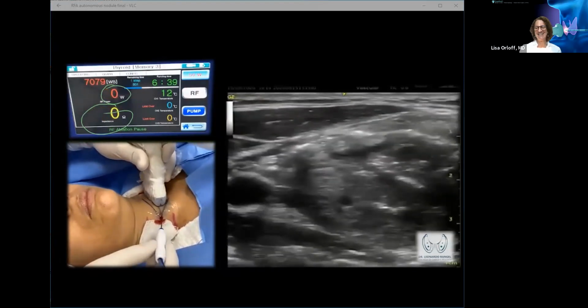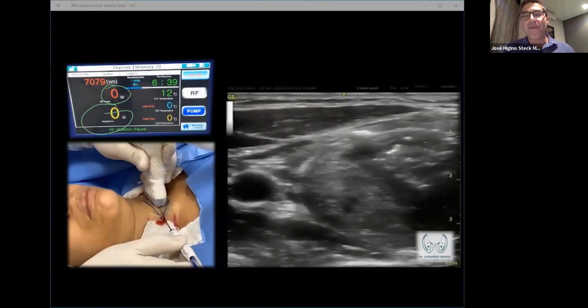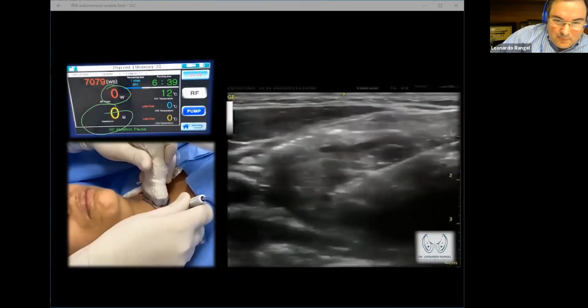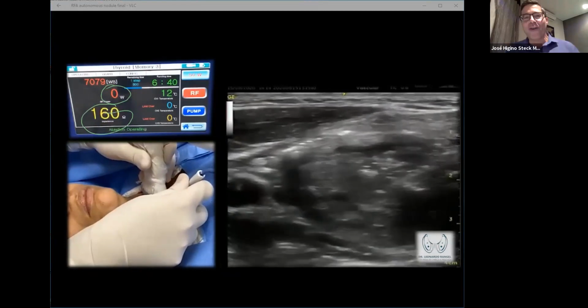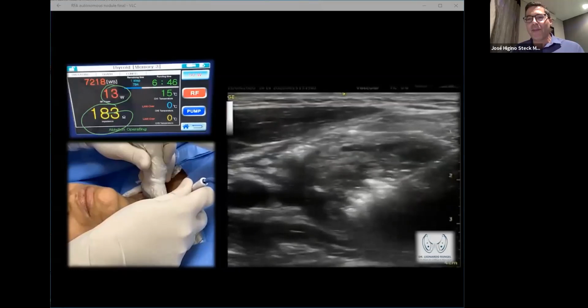I think it is important to talk to the patient to monitor the nerve function too. So yeah, definitely. You don't have to monitor the nerve directly, so you can talk and see if the voice is okay. It's a good way to monitor the voice of the patient.